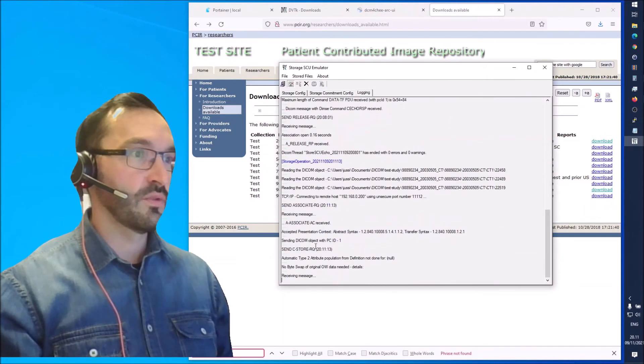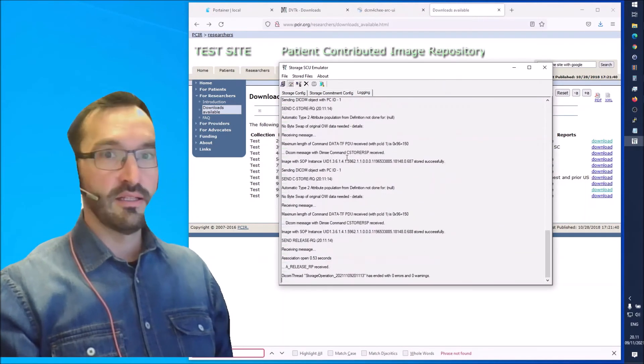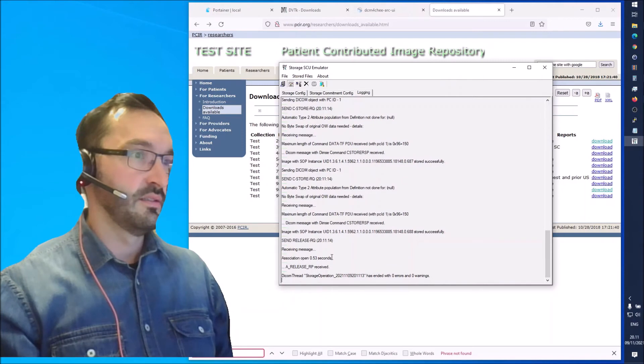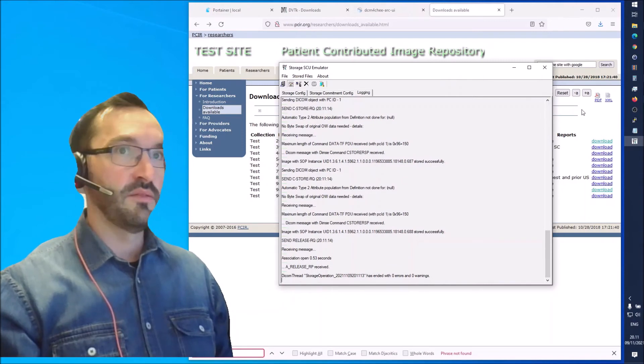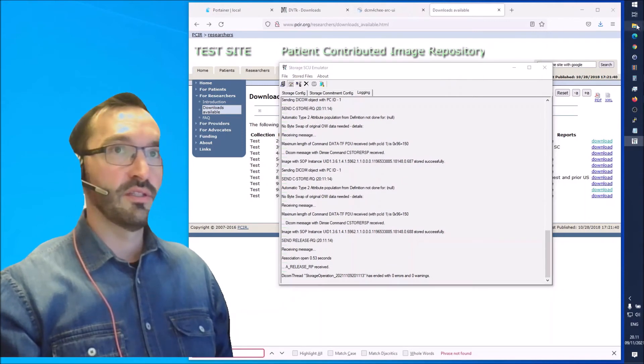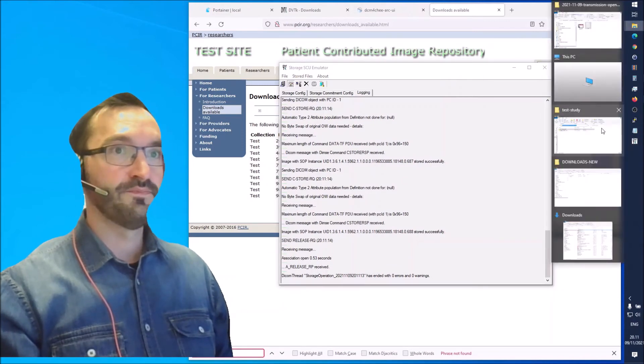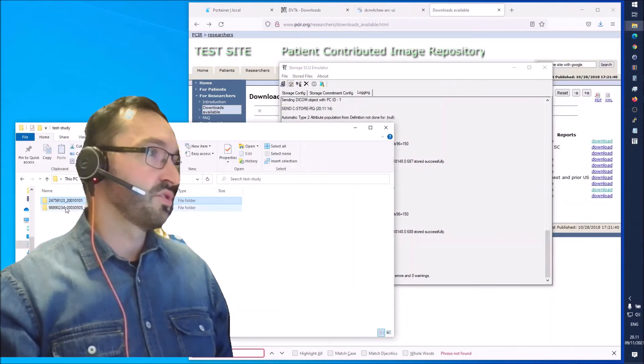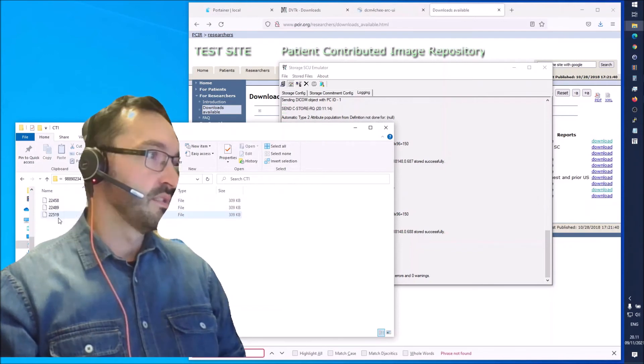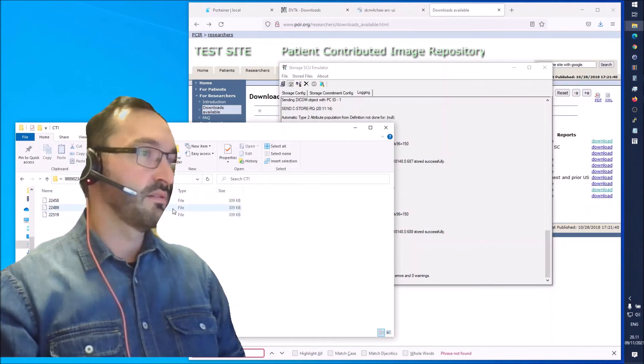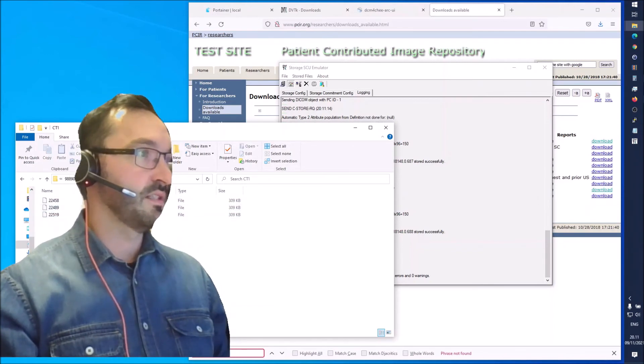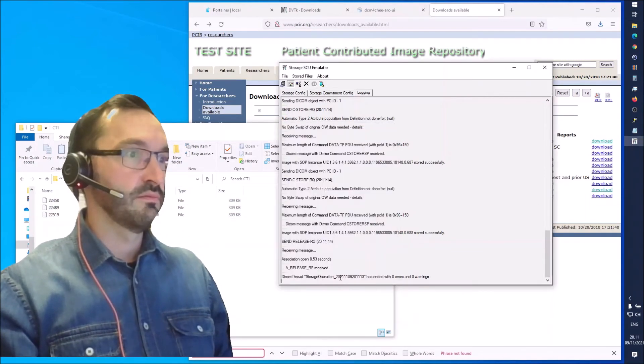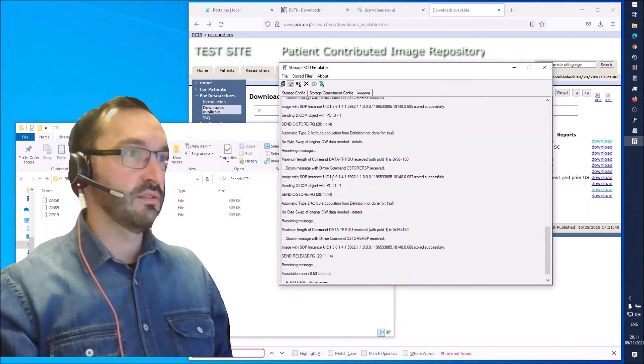Let's select a source directory and go into that test studies folder. Let's select one of the CT studies here, CT number one. Click on okay and it already started sending the images in that folder. It only had three files in it. That was quick to send.